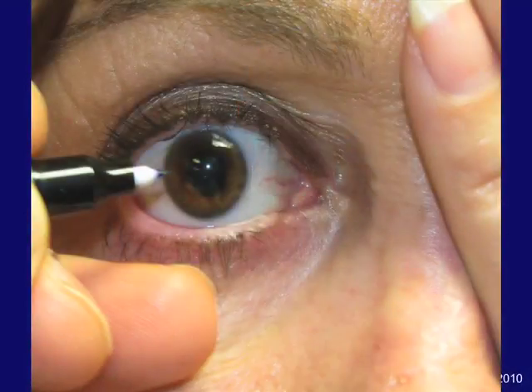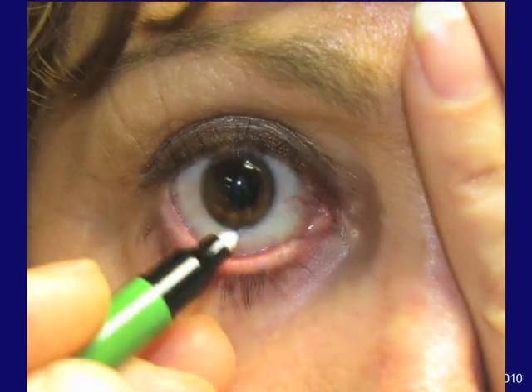Because some patients' eyes can rotate when they go from an upright to a lying position, it's ideal to mark the horizontal and vertical meridians and to do so before the eye is dilated. This can be done in the pre-op area using a methylene blue marker. After getting proparacaine, the patient covers the non-operative eye while the examiner closes one eye. The patient then fixates on the examiner's one open eye.